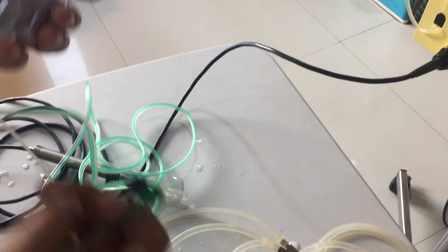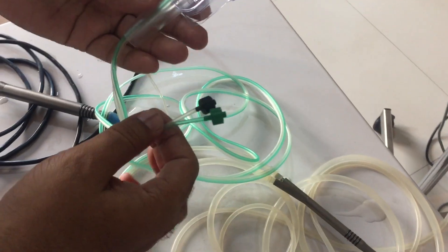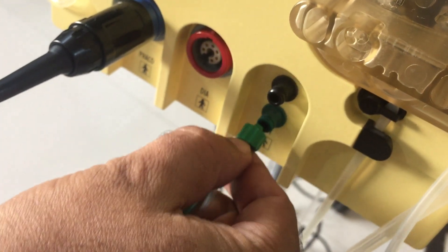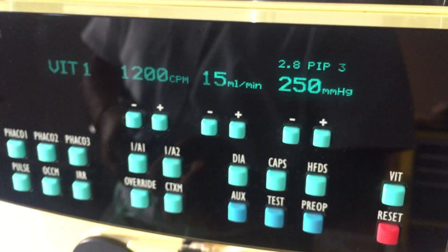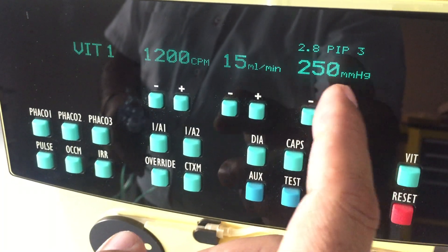If you need vitrectomy — for example, if you have a capsule rupture during surgery — you can use this vitrectomy handpiece. This is the cutter, and here are two pipes going to the machine with two ports: one green and one black. Connect green with green and black with black tightly. Select the vitrectomy function. The settings are: 1200 cuts, 1500 — 15 ml per minute flow rate, and 250 vacuum.